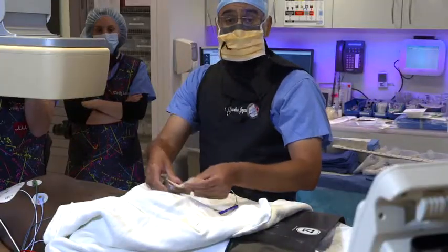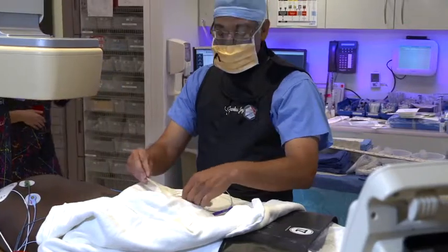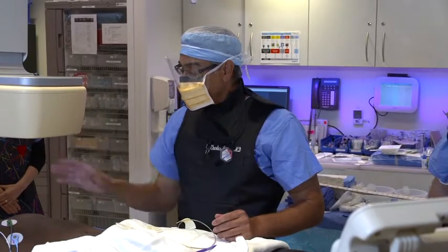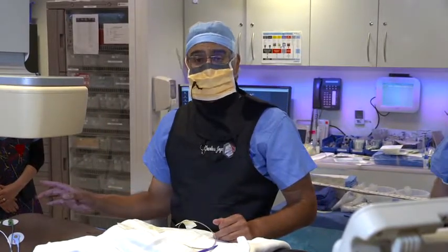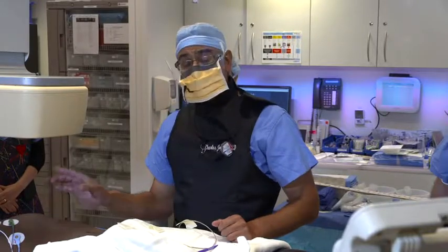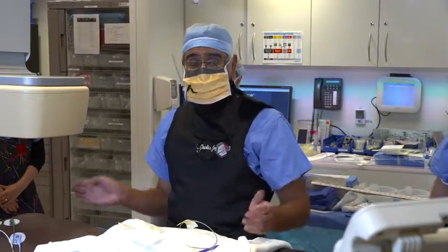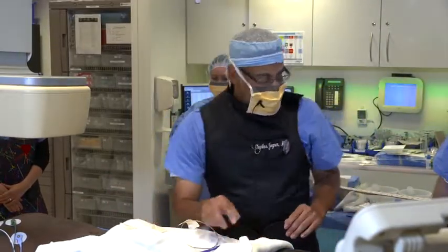You may not have to use fluoroscopy for these procedures as time goes by — we're just cautious because experience with these devices is still relatively new for us. I've been very happy with the results, and a little time spent with fluoroscopy now goes a long way. Overall it's probably not going to be more than about 30 to 60 seconds of fluoro for the whole case. Alright, let's go ahead and get them ready.